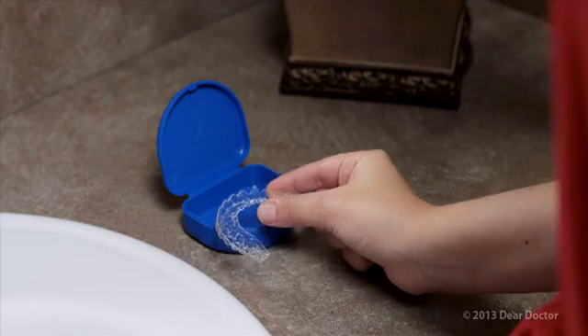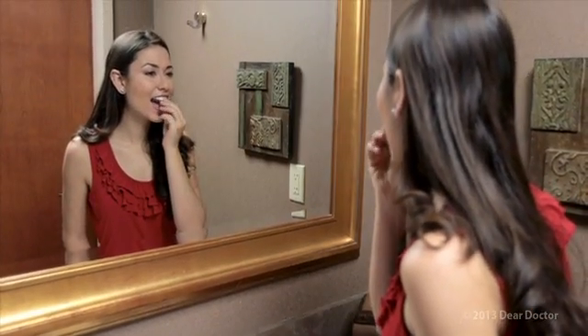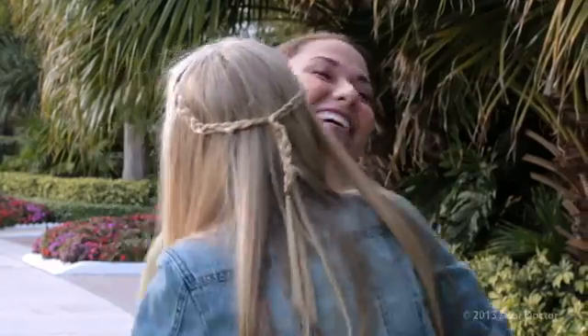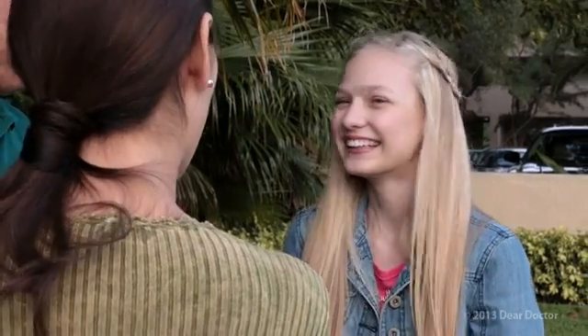Would you love to have straighter teeth but can't see yourself wearing braces? An option to consider is clear orthodontic aligners. Clear aligners are a remarkable way to improve your smile. They're actually clear plastic trays, so they're nearly invisible. This appeals to many adults who prefer a more discreet form of orthodontic treatment to feel at ease in professional and social situations. Some teenagers, too, would rather wear less obvious orthodontic appliances as they develop a positive self-image.